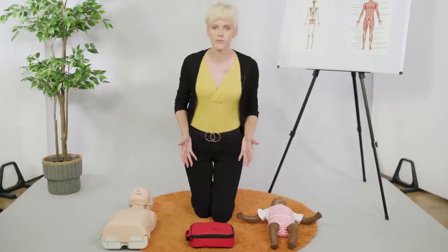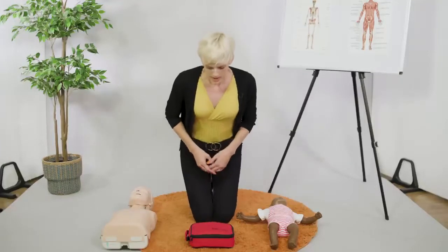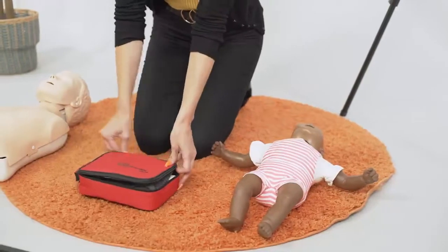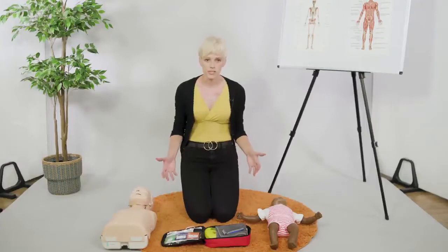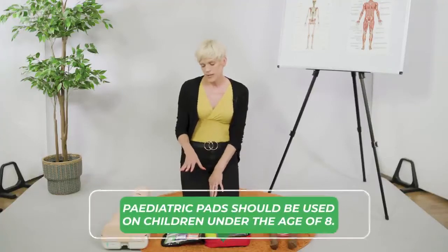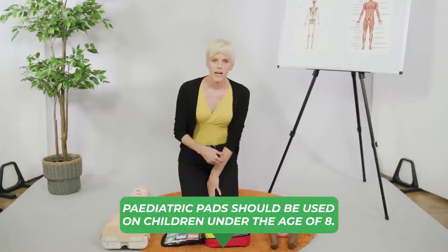When the defib comes to us, we're going to apply it, but it is a little bit different than what we saw on the adult earlier. You would usually have pediatric pads with your defib, or you may have the ability to change the amount of joules — the amount of energy — going through to the casualty. Pediatric pads are for under the age of eight.